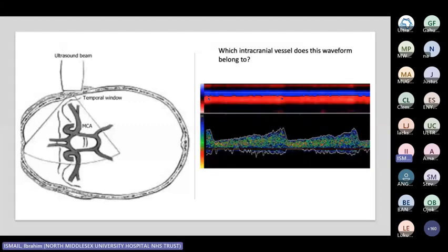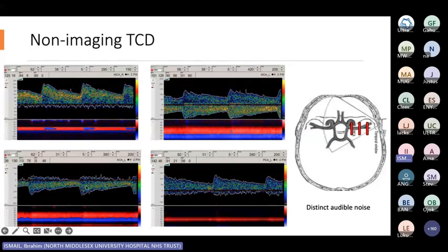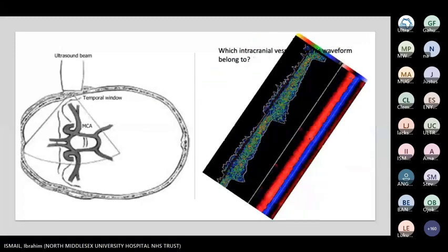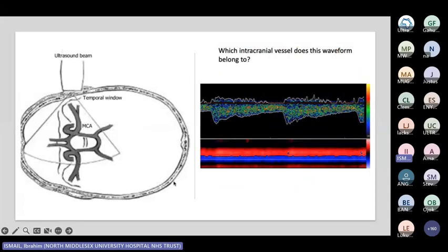Essentially, you can see here, this is the image of the ACA, and it's the ACA upside down. You can see this parameter shows when you are inside the vessel, and gives you an understanding within the vessel itself.